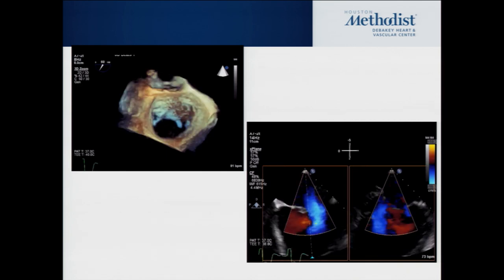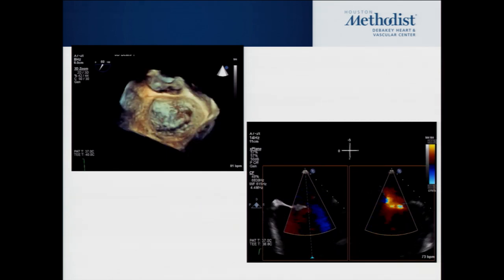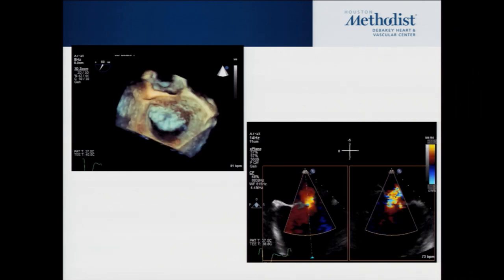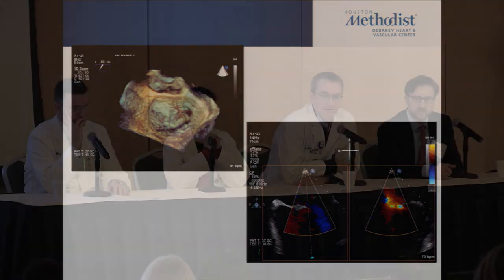Well, I'll just comment a little bit. The decision making around this patient is clearly that he has a significant secondary MR, has symptoms, and I think we can probably agree, is on optimal guideline directed heart failure medical therapy, including resynchronization. So really the choices are just carry on as is with no structural intervention. That's always an option, but in this case, he's probably not going to do well with that option. Consider a percutaneous solution or repair of the valve, which we'll talk about here, or a surgical solution. So it's not necessarily off the table to consider surgery.